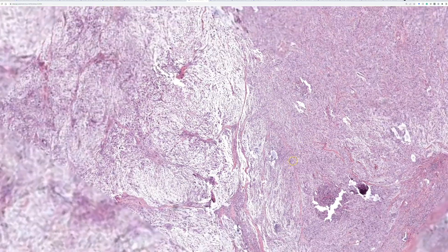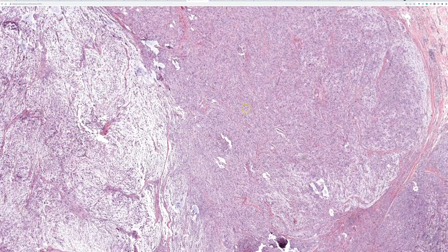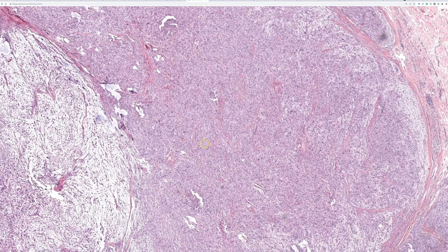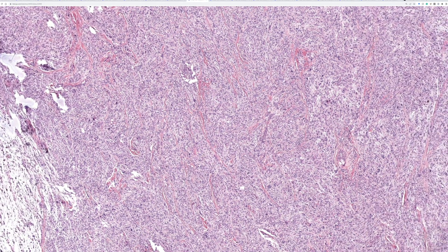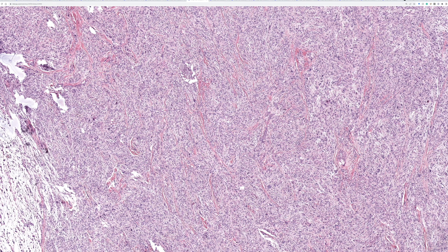This appearance also makes me think of epithelioid fibrous histiocytoma, which has a similar cytologic feature. Fascinatingly, the large studies by Chris Fletcher and Jason Hornick - still the largest series in the literature - showed that even with atypical mitotic figures, bizarre pleomorphic nuclei, and hypercellularity, all patients still had a good outcome. These tumors look malignant but do not behave in a malignant fashion. In cellular neurothecoma, nuclear atypia and mitotic activity do not predict behavior.